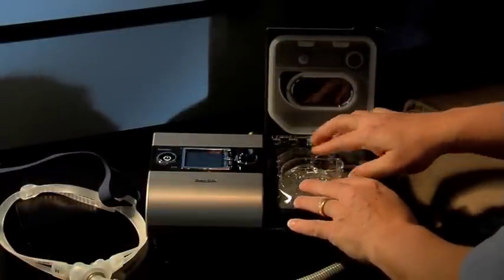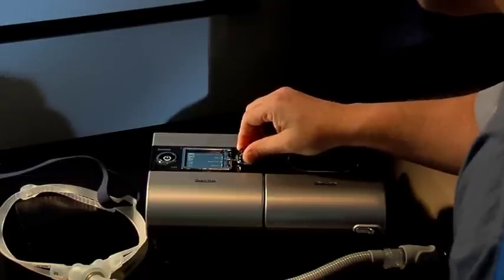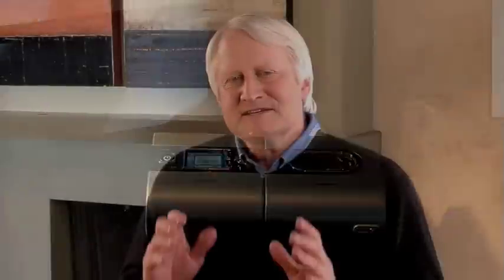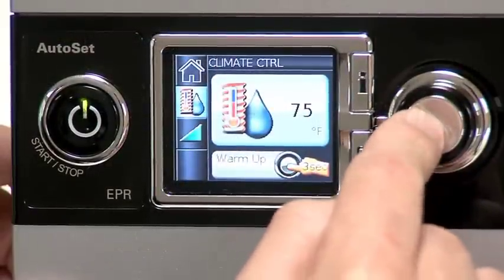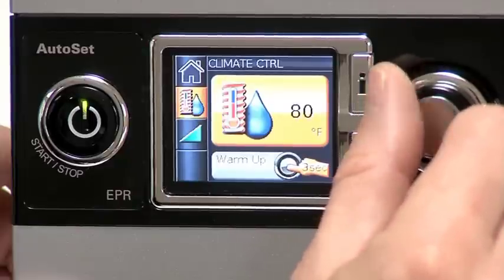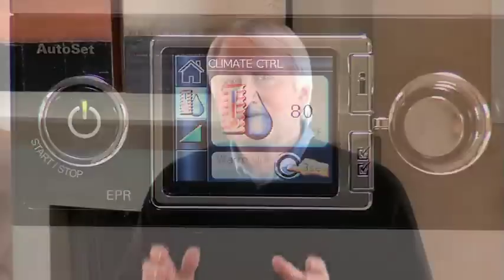Heated humidification takes this discovery one step further, allowing you to feel even more comfortable, meaning you sleep better at night, feel better in the morning, and have more energy all day long. Standard heated humidifier systems deliver humidification based on arbitrary settings, which means it can be insufficient or too much humidification. But with intelligent climate control, your CPAP device is automatically adjusted for the temperature and humidity levels of your bedroom, instead of relying on some arbitrary setting. This protects your airway and makes your sleep therapy more comfortable.